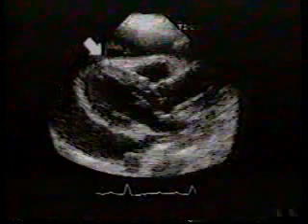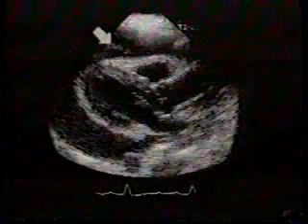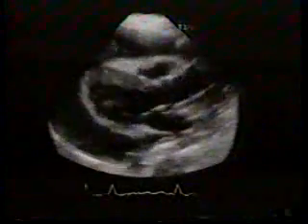the epicardial surface. In real time, you will see that the heart swings slightly within the large effusion, and you will also see diastolic collapse of the right ventricle, a feature of tamponade which we will discuss later. In apical four-chamber format, the shaggy epicardial border and the clumps within the pericardial fluid are more apparent. In real time, you will see the right atrium collapse in diastole, another 2D sign of tamponade.